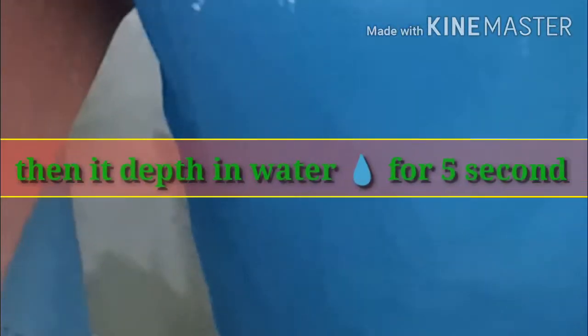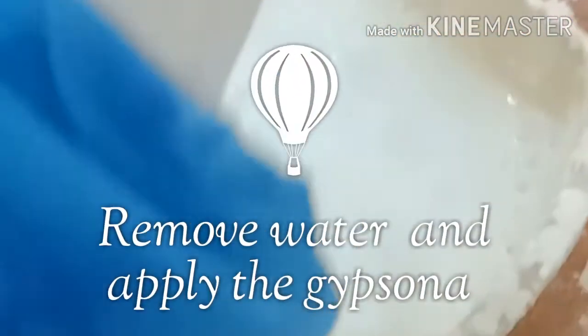When you apply gypsona on the target area, be careful at this time, because gypsona consists of about 70% gypsum, and gypsum is an irritant for the skin and can damage the skin. And then take water in a tub, dip the gypsona in water for 5 seconds, and then remove the excessive water from the gypsona.